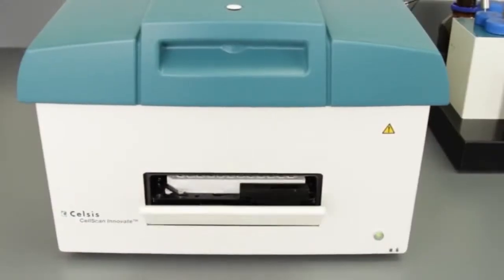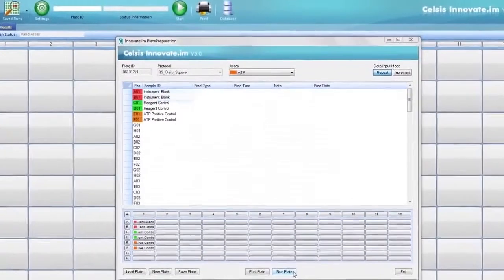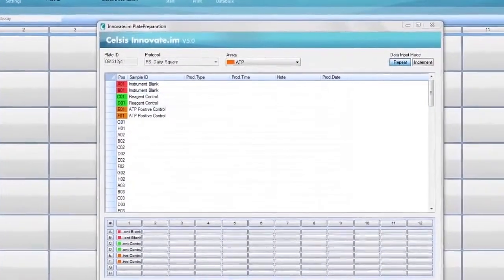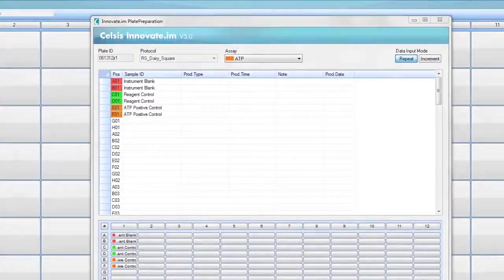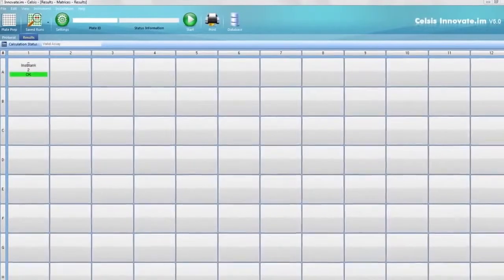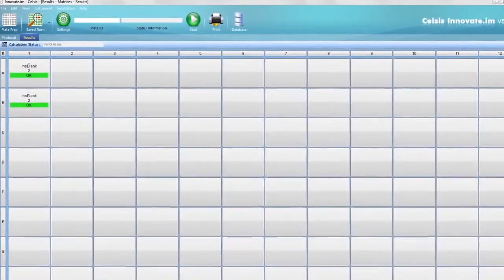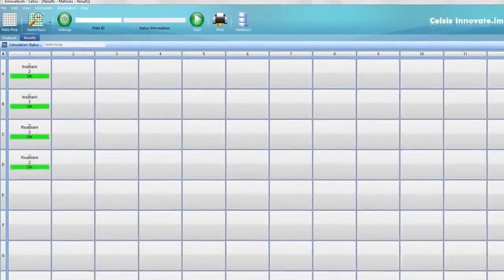Good lab practices include running daily controls for an instrument blank, reagent control, and an ATP-positive control. To ensure that the instrument and reagents are working properly, always verify that the controls pass before testing your samples.